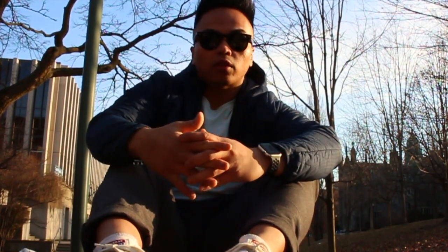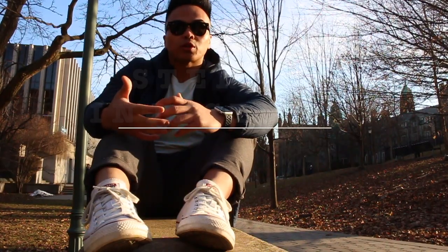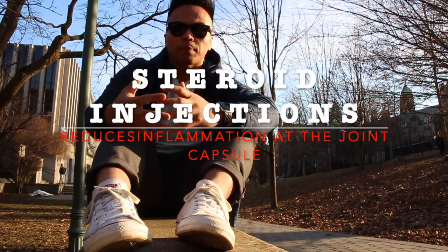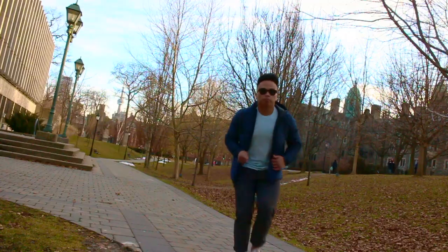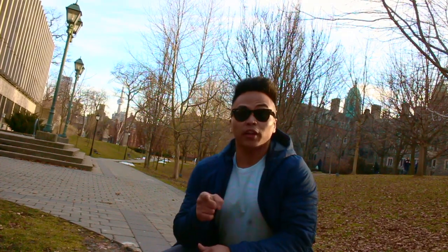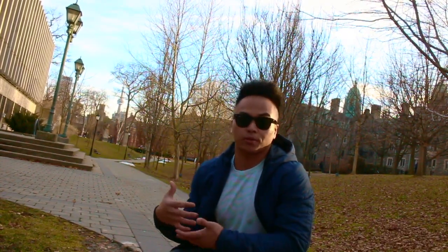Hydrocortisone injections should only be done if regular analgesics are not working anymore. And hydrocortisone is useful because it's a very powerful drug that helps alleviate the pain. And the third and final reason why we may need to use image-guided joint injections is for specimen collection for diagnosing any infection at the joint spaces.